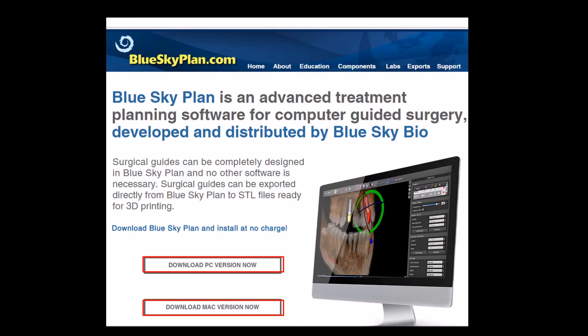Blue Sky Plan is an advanced full-feature treatment planning software for computer-guided surgery and can be downloaded from blueskyplan.com. Blue Sky Plan allows all users to design and fabricate surgical templates for all guided surgical kits and all implant systems. The software and software updates are distributed free of charge.